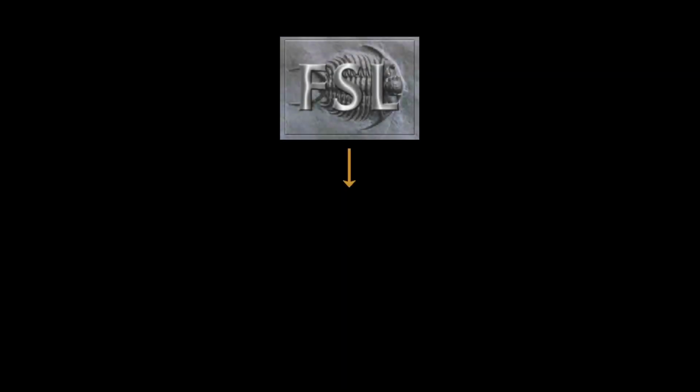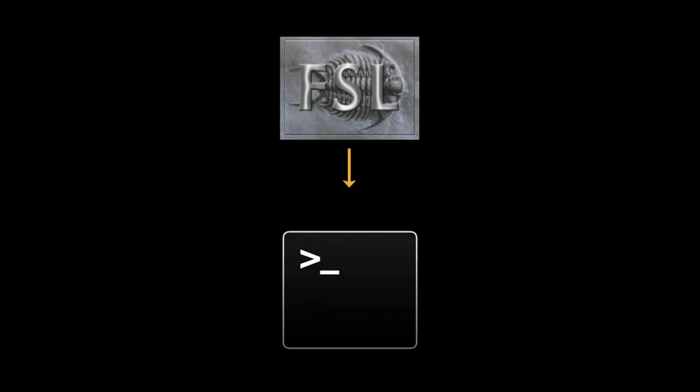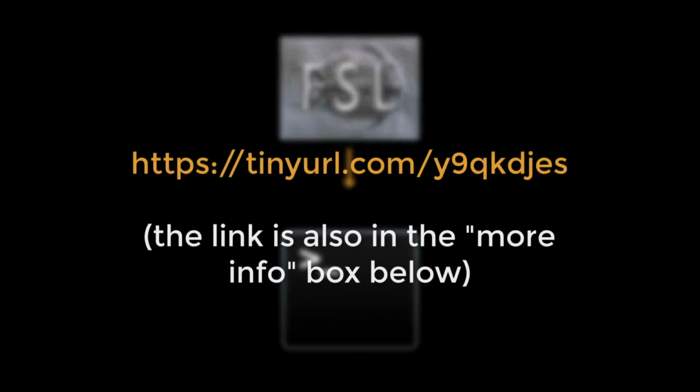Now that you've become more familiar with Unix commands, we can download an fMRI package and install it with Unix. If you haven't already downloaded FSL, watch this video. When you're done, come back to this tutorial.